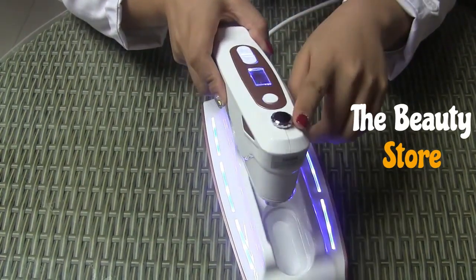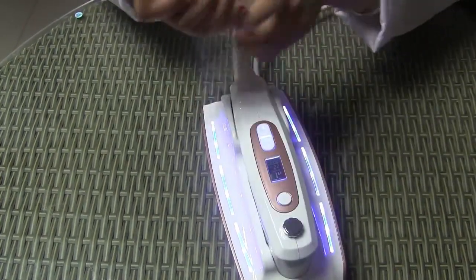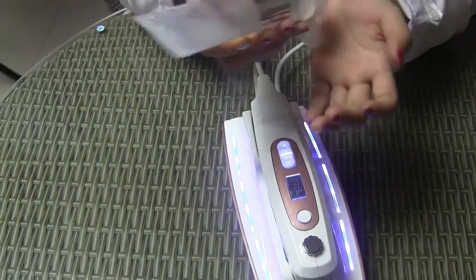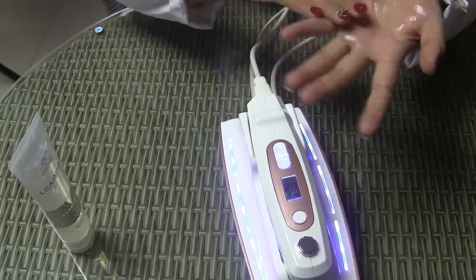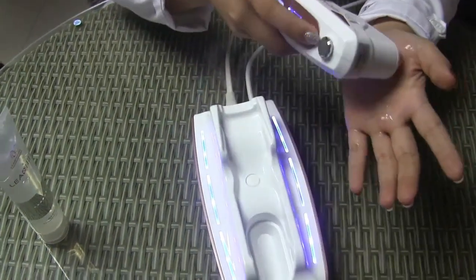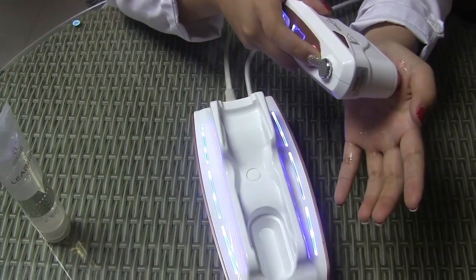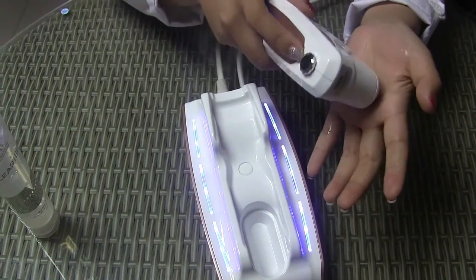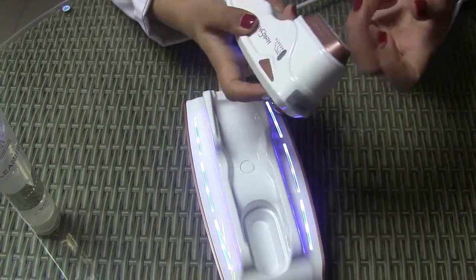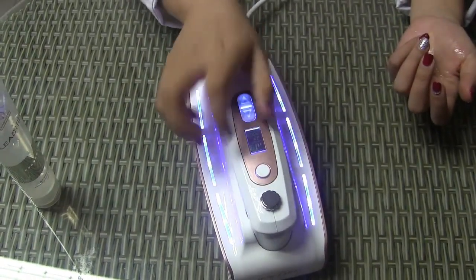And when we have adjusted the depths and the energy, we put some gel. We can put some gel on the skin and press this button. Okay, when it finishes the 22 dots, the machine will turn off. And that's how to operate this machine.